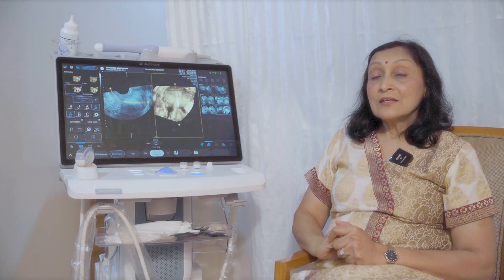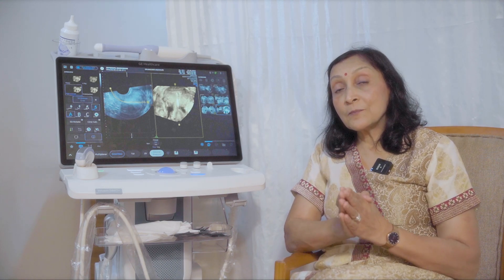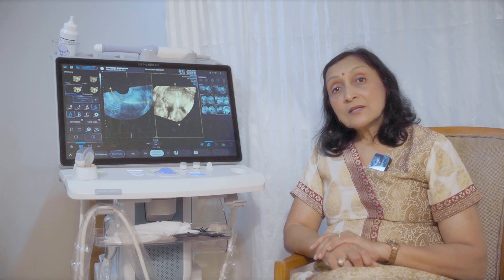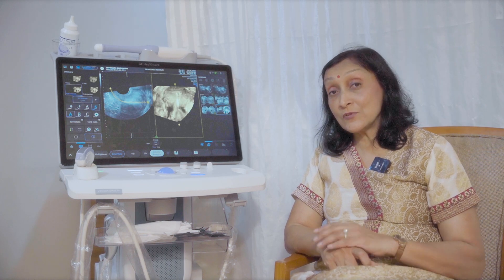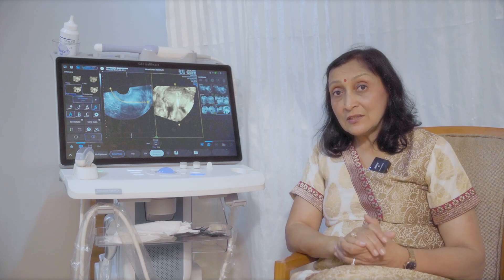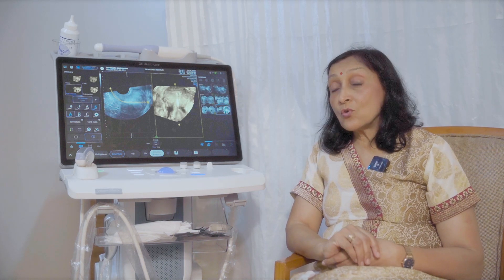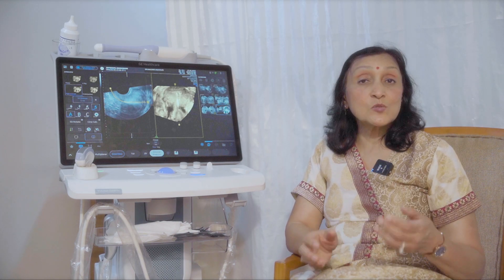That is why you can do easy manipulation of the 3D volumes that you have acquired. You just have to tap on the image and all the essential rotations — X, Y, and Z rotation — can all be done just by the touch screen. You can use OmniView with the touch screen, which is an excellent tool to diagnose all your uterine abnormalities, Mullerian abnormalities, as well as fibroids, polyps, and so on.